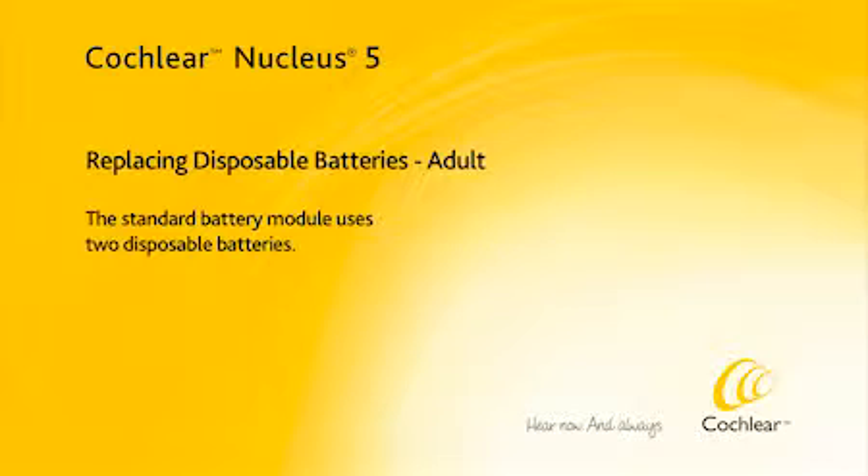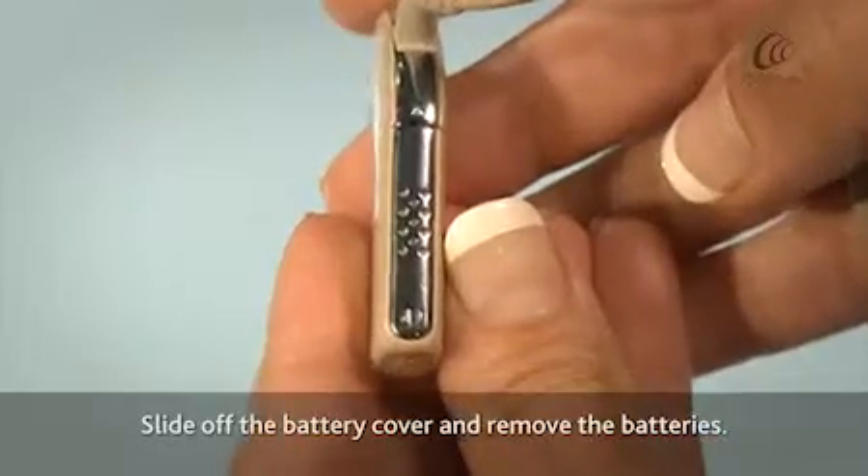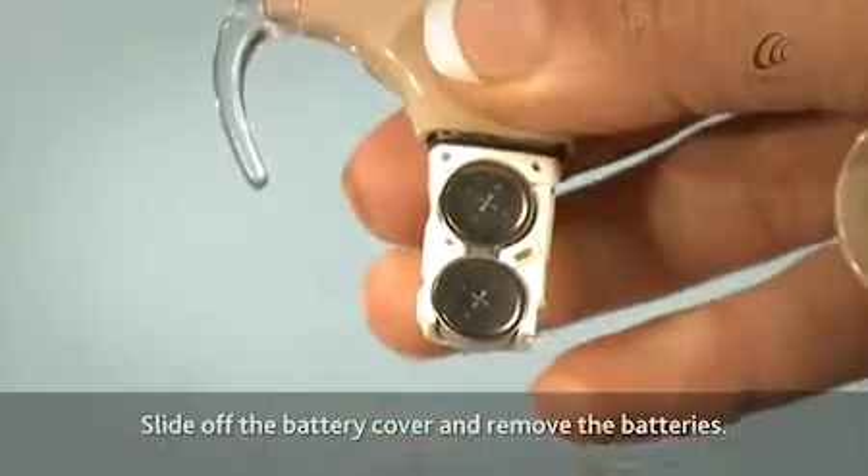The standard battery module uses two disposable batteries. Slide off the battery cover and remove the batteries.